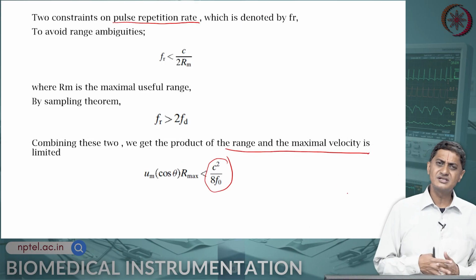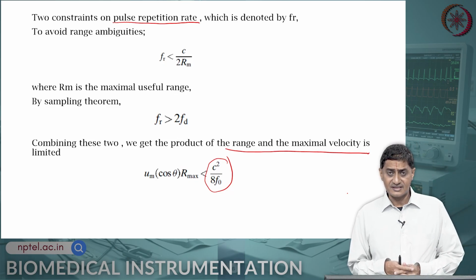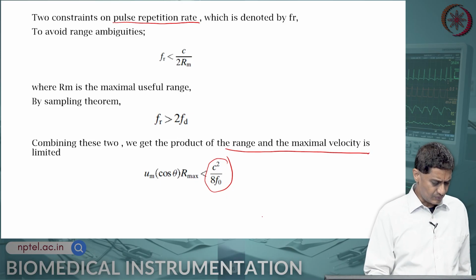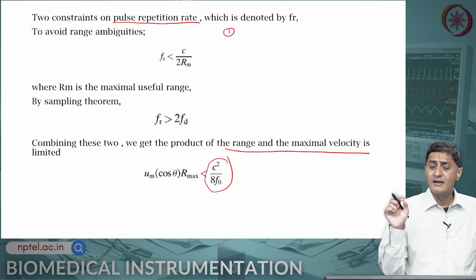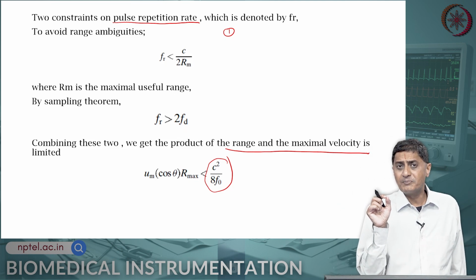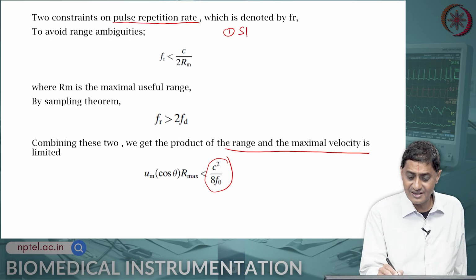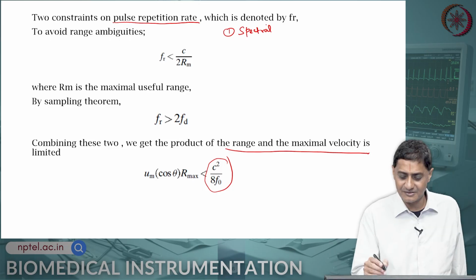Are there any more constraints other than these? The answer is yes, there are other constraints. The measurements are even more constrained. Why is that? Because your pulses are of a very brief duration, that is they are time limited signals, there is going to be spectral leakage, a sort of spectral spreading that is going to happen.